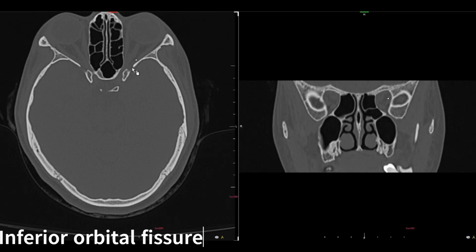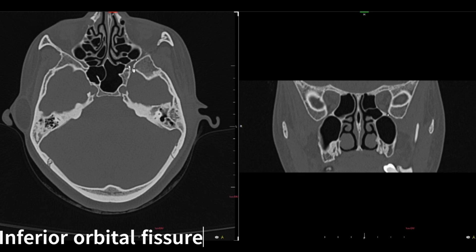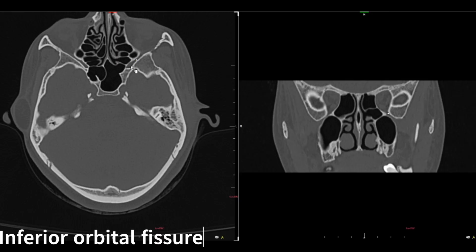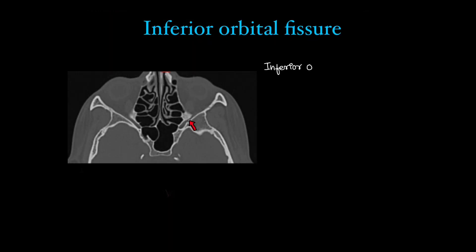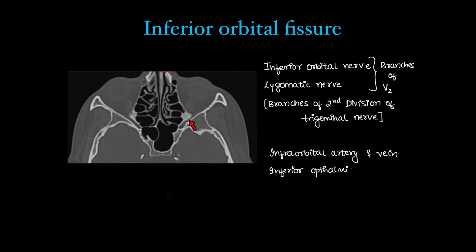Next we have the inferior orbital fissure. Going down posterior to the orbit, you can see this projection — that is the inferior orbital fissure. On coronal, that is the inferior orbital fissure, which joins the pterygopalatine fossa — a pyramidal-shaped structure behind the maxillary sinuses. Contents include the inferior orbital nerve and zygomatic nerve, which are branches of the second division of the trigeminal nerve (V2), as well as the infraorbital artery and vein, and the inferior ophthalmic vein.